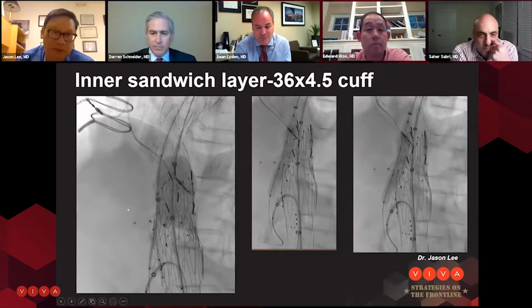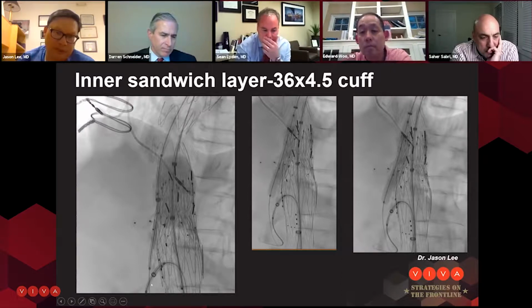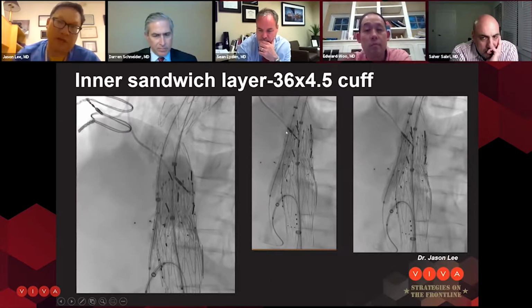Okay, so then this is again the 32 thoracic device, the 8 French sheath, the 779 VBX in position, the ZFEN, the top is deployed, and the 629 VBX is out the renal through the fenestration in a 7 French Ansel. We pop the top of it. Remember, there's only about 28 millimeters of fabric to the top of the ZFEN, so to make it a true sandwich, you need a lot more overlap of fabric. So then I took a cuff that was larger than both the thoracic piece and the ZFEN piece to make the inner layer of the sandwich. So now you've got the thoracic piece, the 779 VBX, and then the inner cuff.